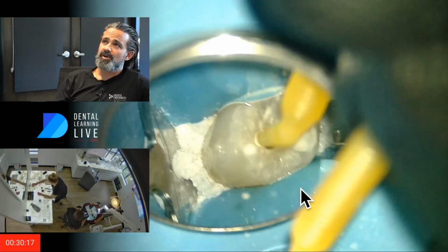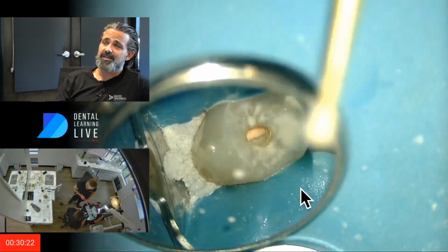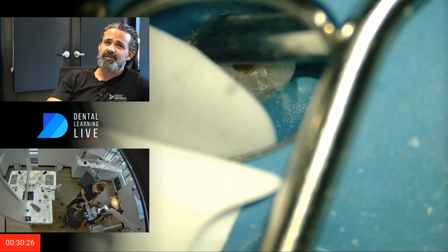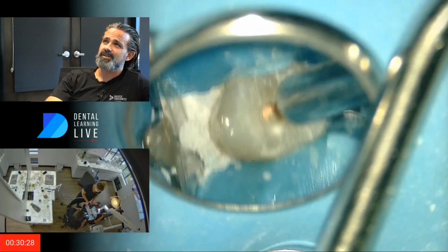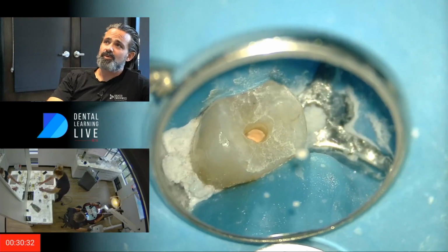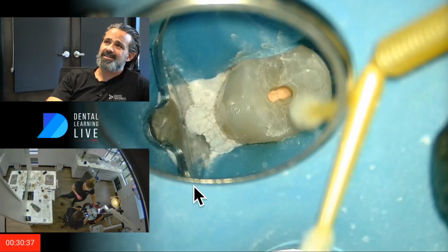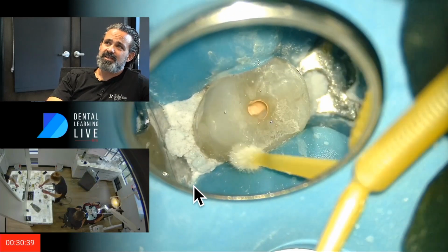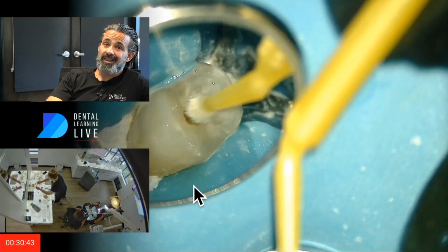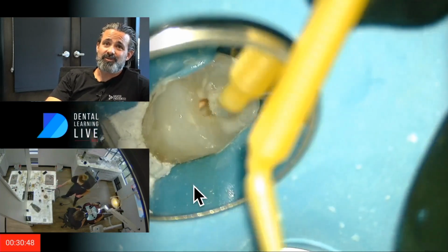Now, my bendy brush that I'm using is just a yellow, and that's about the width of the access. It's not a wide brush, it's just the standard yellow one. I think it's like a 2 or something. But anyways, I'm just cleaning up that with isopropyl alcohol. You can go one step further and take a conditioning agent. I don't acid etch, but I like the conditioning agent because it just kind of cleans up the residual. And that's why I like it if I'm doing a bond, but I tend to use it even when I'm not actually doing a permanent filling.